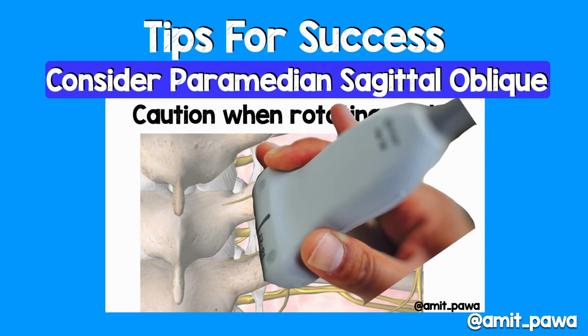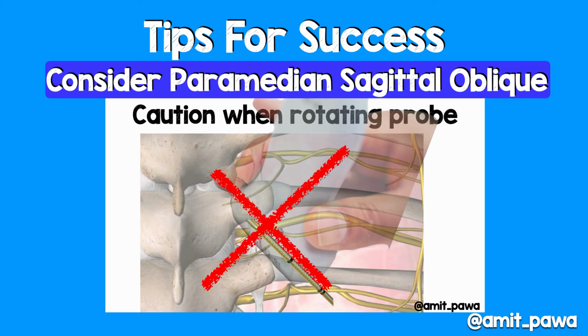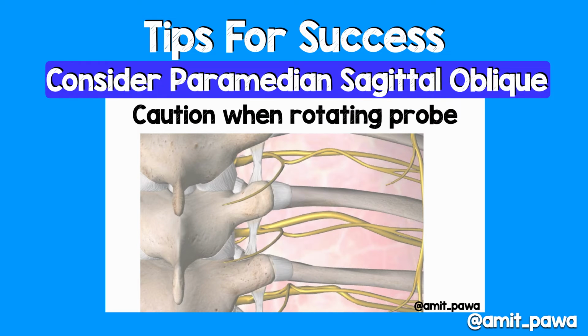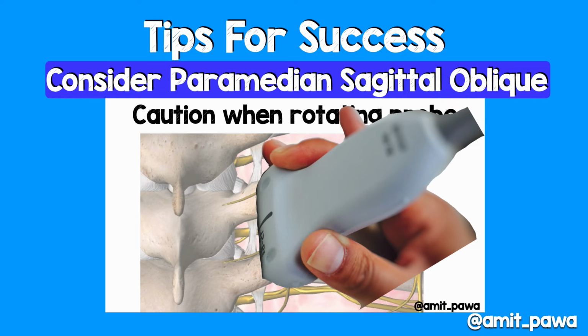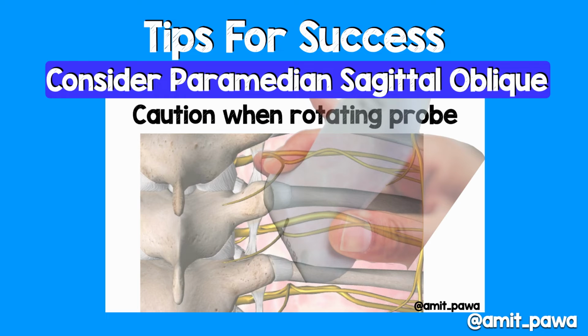But you must be careful when rotating the probe. You don't want to rotate the probe like this, so the superior part of the probe comes towards the lamina, because then you're needling towards the central neuraxis. Instead, once you've got to the transverse processes, what you want to do is to pivot on the cephalad part of the probe, so that way the cephalad part of the probe stays where it is, and when you needle in plane, you make sure you're still targeted towards the paravertebral space, but from a safe angle.